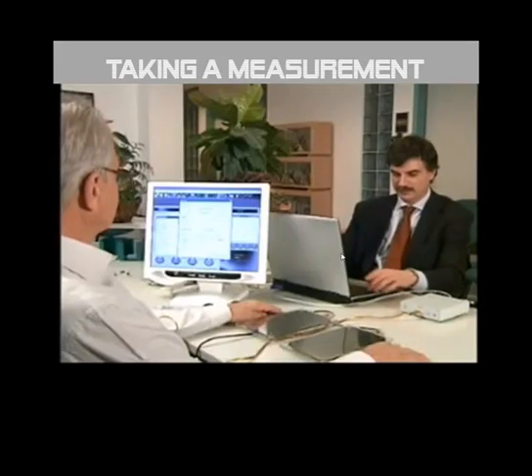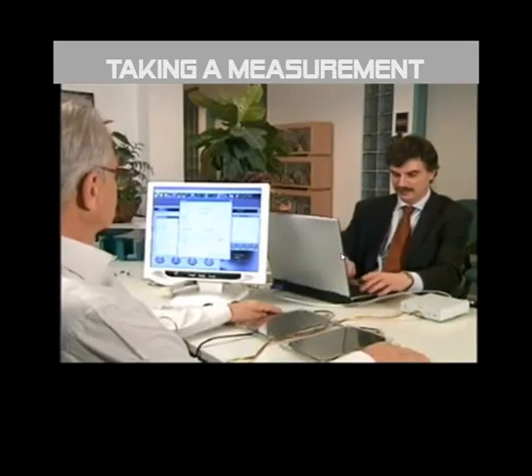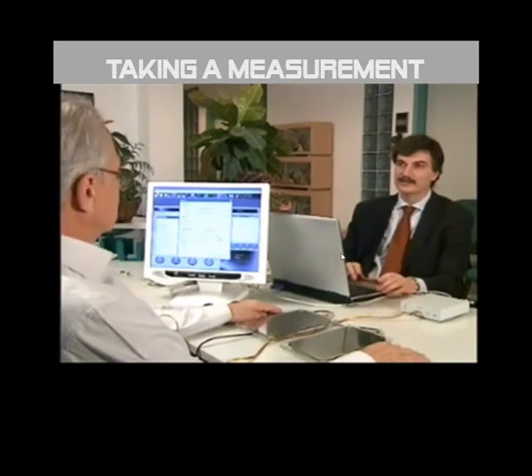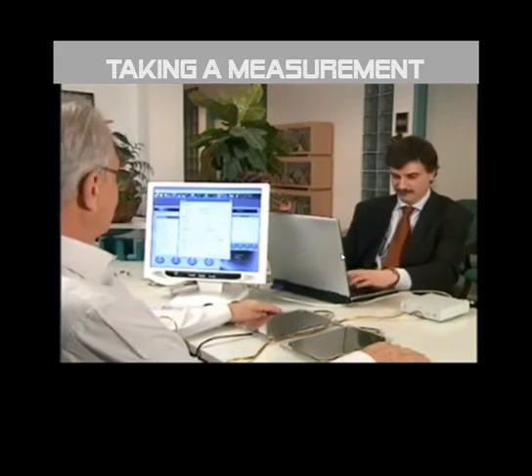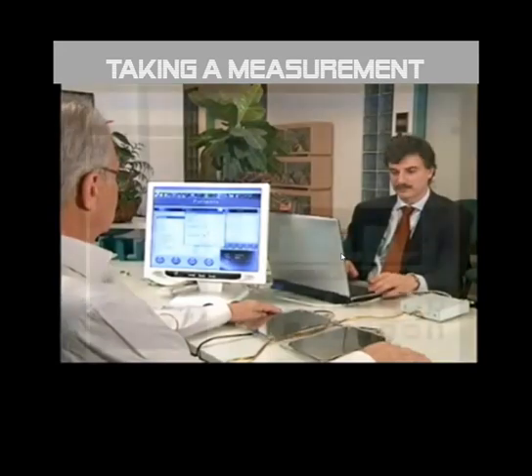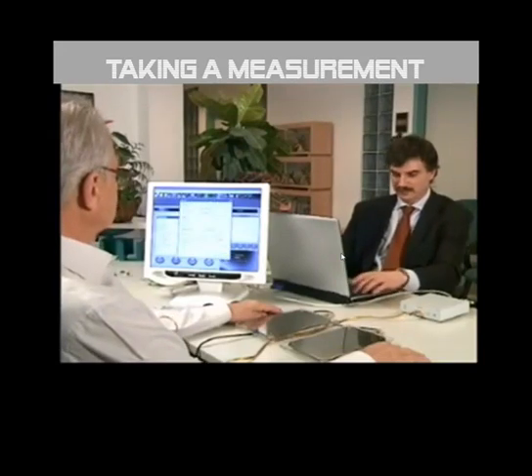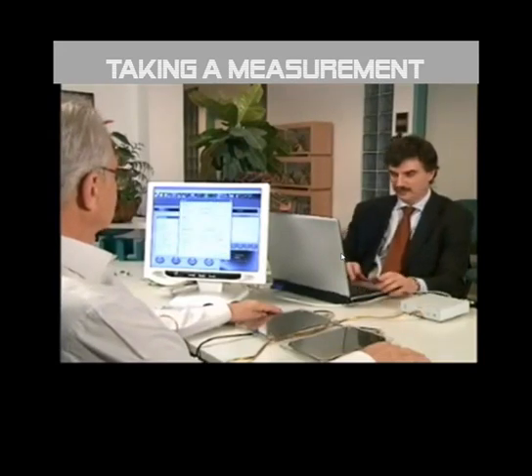The ESTEC is a non-invasive medical device using tactile electrodes and biosensors, and allows the data recording of 5 technologies in only 5 minutes. The recordings are displayed in real time, and then analyzed and saved in software.